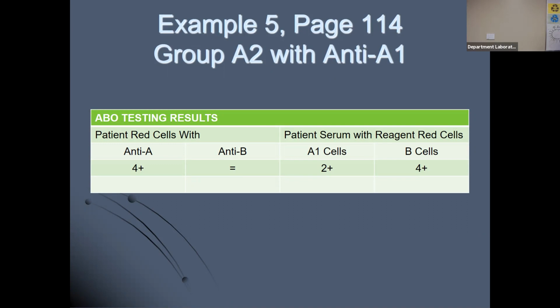Rouleaux, you'll see that a lot. You'll do the saline replacement a lot. If you have a patient that has been transfused a different type multiple times, like that B patient that was transfused with multiple O types, that could affect your testing. Depending on what hospital you work at, if you do a lot of bone marrow transplants, you could have patients that are changing types. I saw that several times here at UAMS. And so we'll talk about that later on, like how we transfuse those patients. But the acquired B and the B(A) phenotype, you probably won't see those very often.